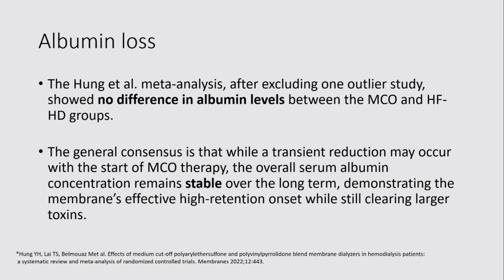So coming to albumin loss, it has been found in one meta-analysis, after excluding one outlier study which used an earlier version of this particular Theranova dialyzer, there was no significant difference in albumin loss as compared to high flux hemodialysis groups. So the general consensus is that while a transient reduction may occur at the start of MCO therapy, over a period of time it gets stabilized.